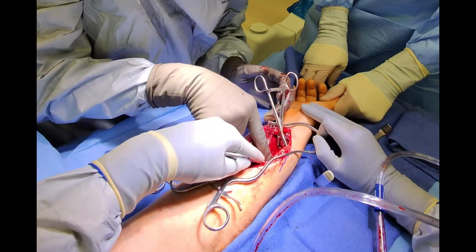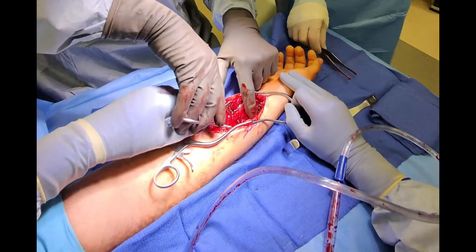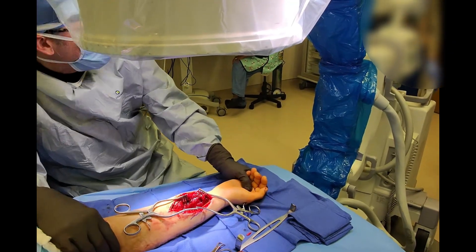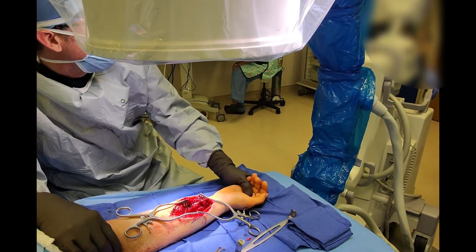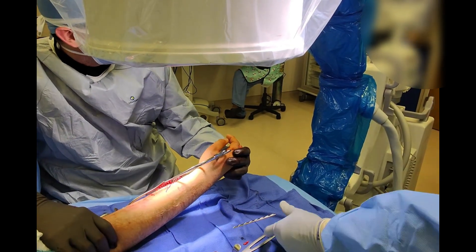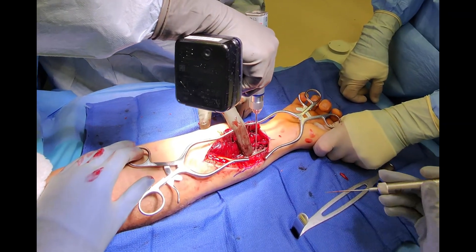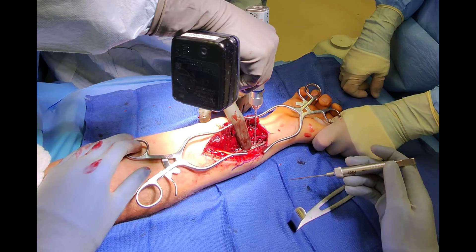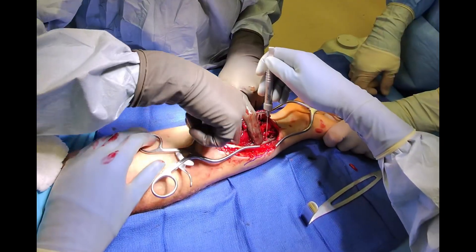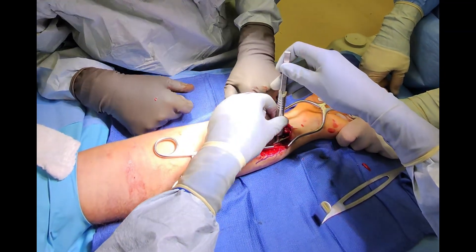With the fracture provisionally secured, we can remove the bone clamp and bring the C-arm in for x-ray imaging to assess the bone alignment. With an acceptable reduction of the bone, we can now span the fracture with the plate and screws. The purpose of the plate is to neutralize shearing and rotational forces that the lag screw cannot address. Together the screws and plate create a robust healing construct.